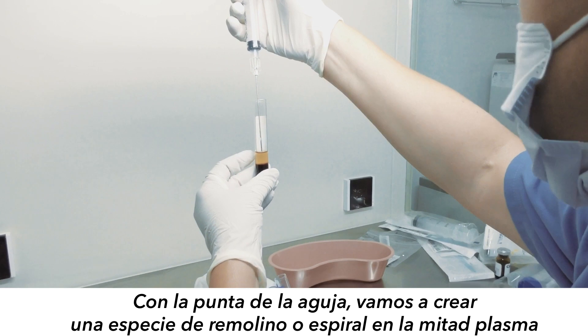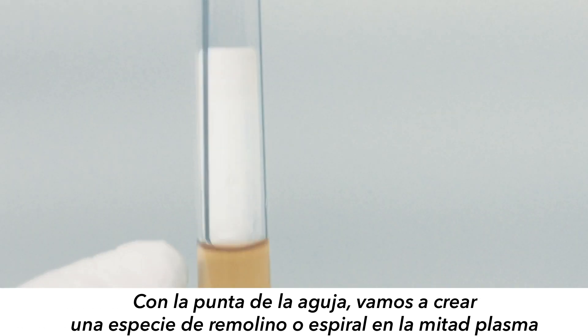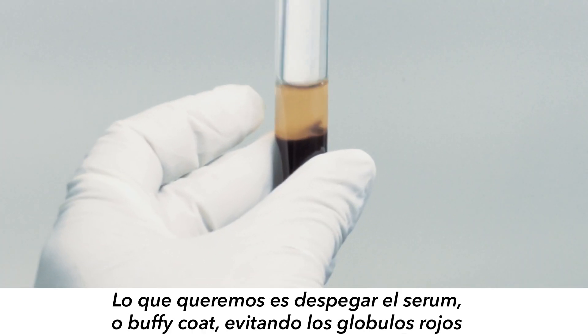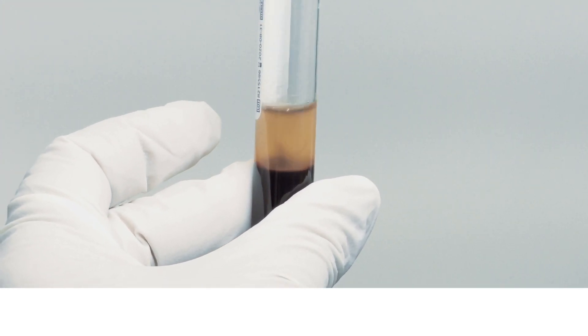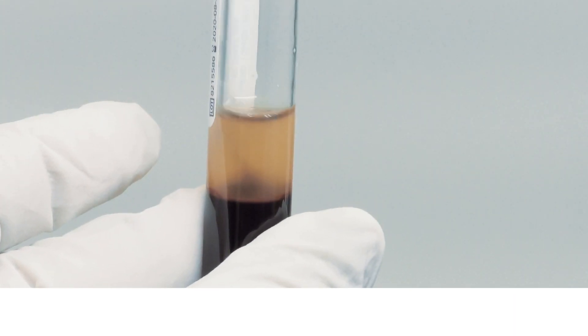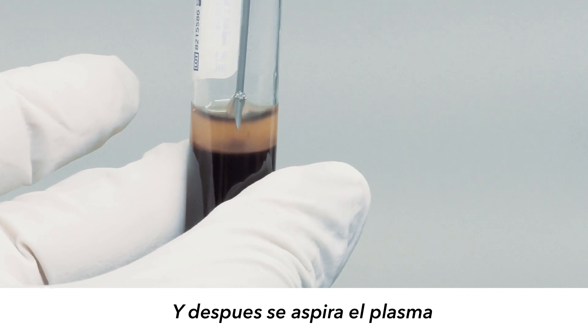Place the tip of your needle in the middle of that one milliliter and start shaking — twirling it around with the serum, which is what you want. You want to detach it and you don't want to get a lot of red. Then you aspirate.